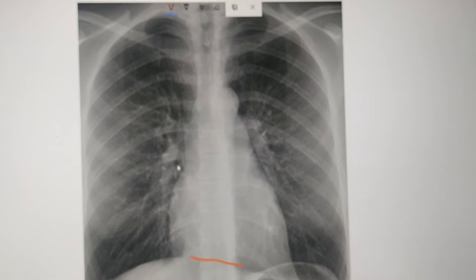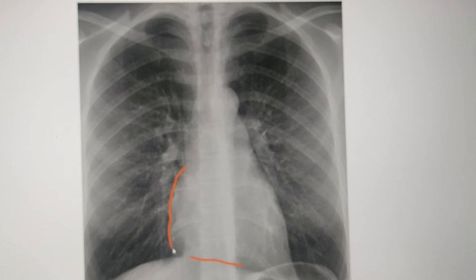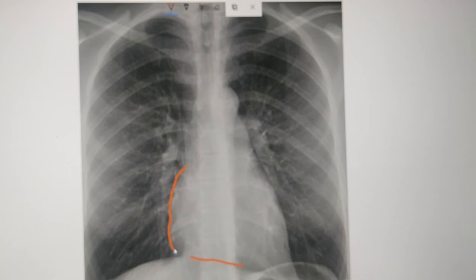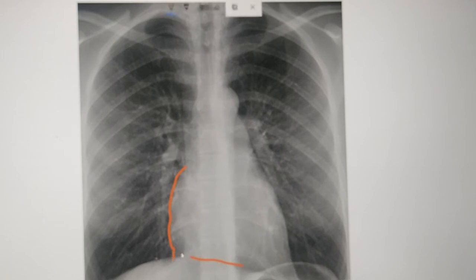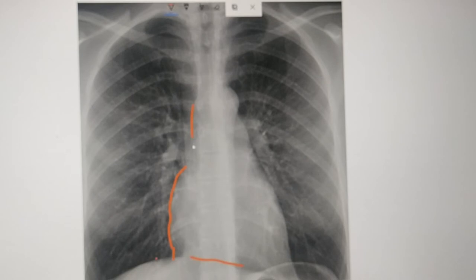This is the right border of the heart, this is the left border of the heart, and this is the inferior border of the heart. The right border of the heart is formed mainly by the right atrium. The lower part — the lowermost part — of the right border is formed by the inferior vena cava. The upper part is formed by the superior vena cava.